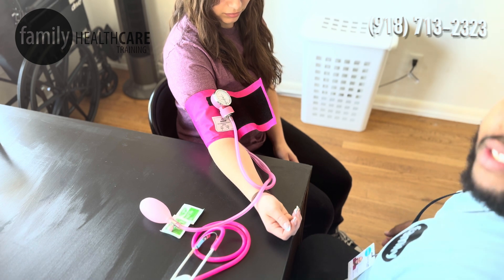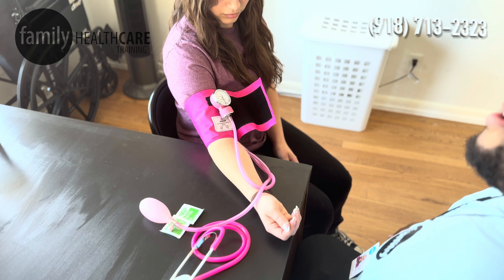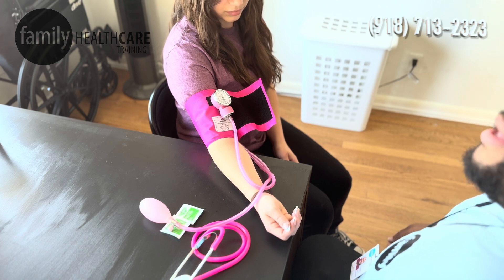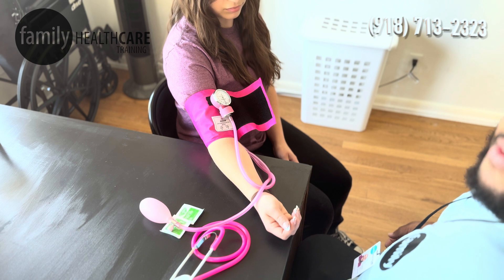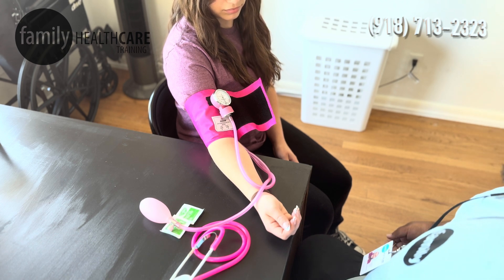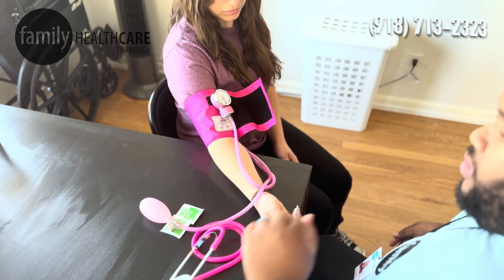Now if your patient is coming in in a hurry — they're late to their appointment, they're having lots of anxiety — we want to make sure that we give them 10 to 15 minutes to sit so that their blood pressure can normalize. If not, we can get inaccurate results.